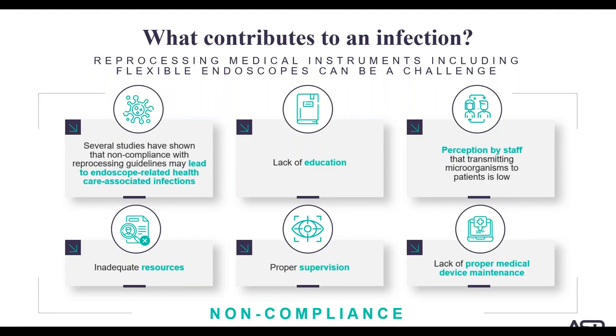Inadequate resources. Inadequate resources can be people. So are the people who are doing the reprocessing, do they have competing priorities? Are they trying to take care of patients as well as reprocess scopes? Or it can be tools or space or workflow. And then lack of supervision. Joe's better than Susie. Susie's known to take shortcuts.